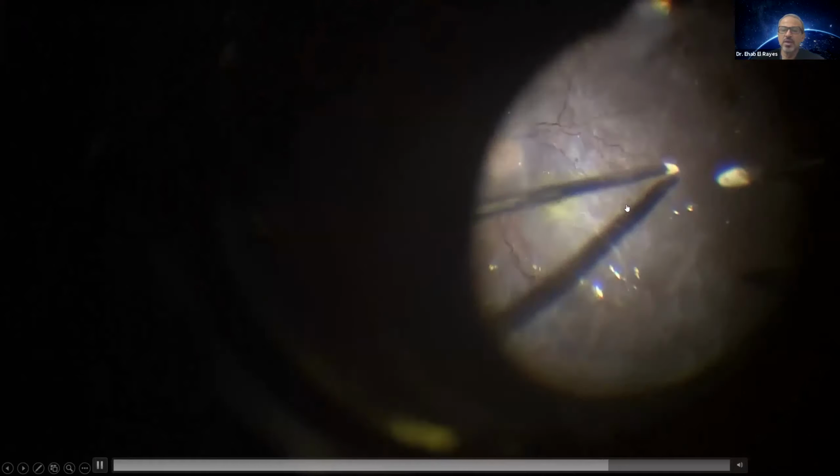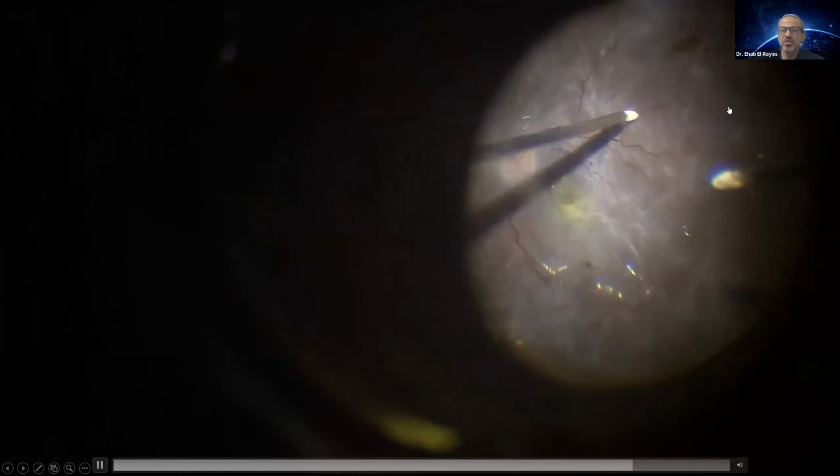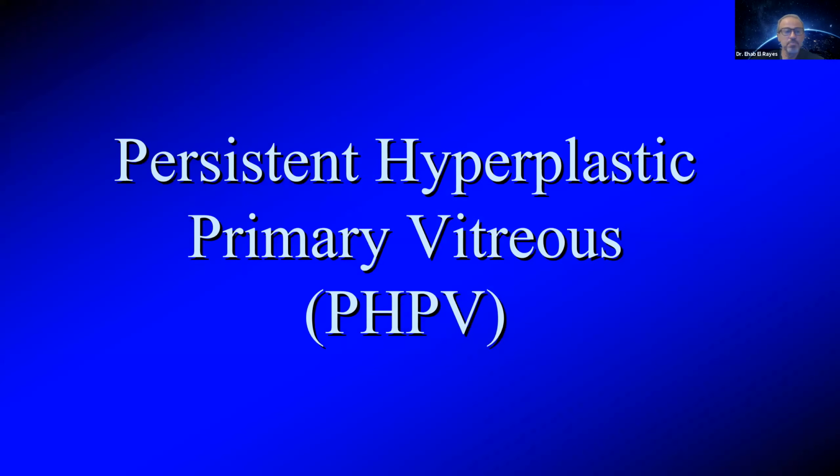So spend time opening up the retina and cleaning the retinal surface bit by bit and putting the buckle at the end, sometimes helpful if you have residual traction. Then you put your laser at the extreme retinal periphery to have some clear posterior pole at the end in cases of giant retinal breaks, which have a high risk of PVR later on. So you have to spend time dealing with these patients.